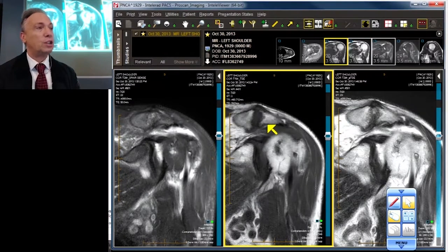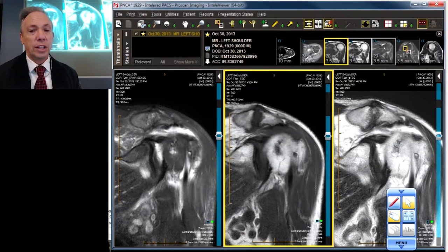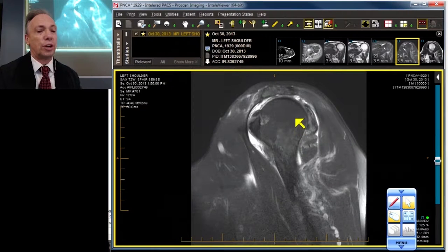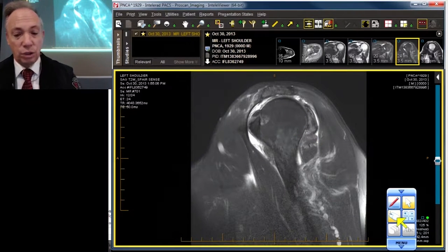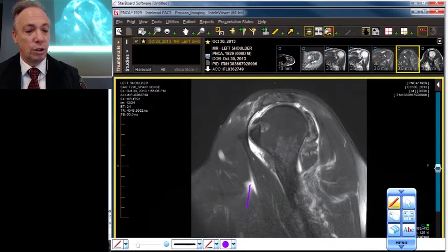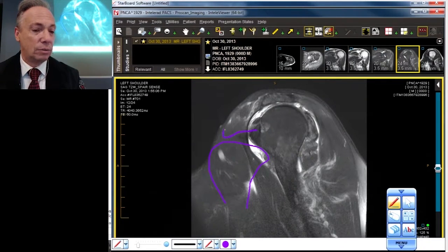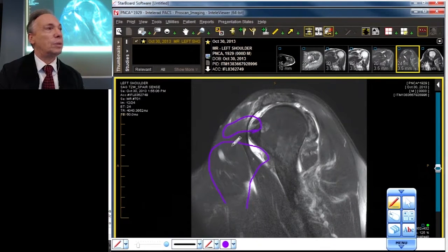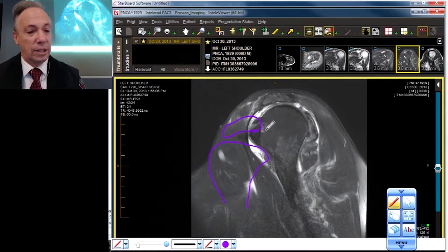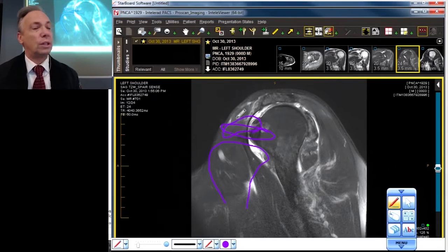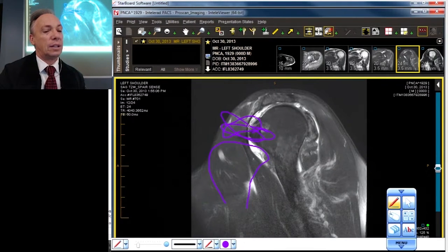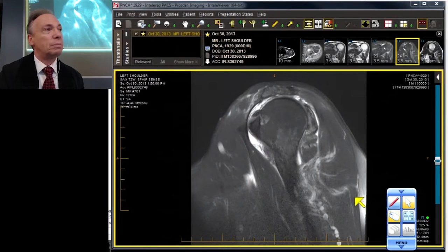In this case it's more bony than ligamentous. Let's take a quick look at the sagittal projection. When we say the acromion is down-sloping, here's what we mean: if the acromion is tilted down from postero-craniad to antero-caudad, it's positively down-sloping. If it's straight in line with the humeral head, it's neutral. If it's angled up, that's negative slope. We don't pay too much attention to that — we're more interested in positive sloping.